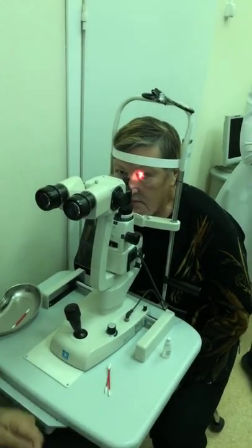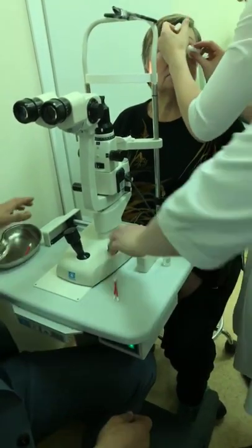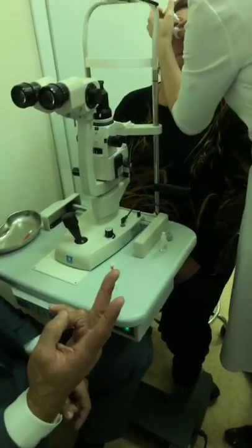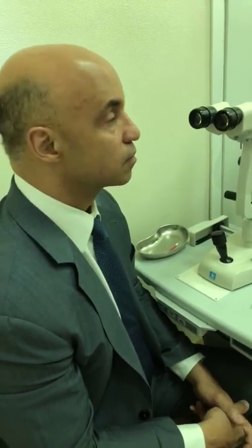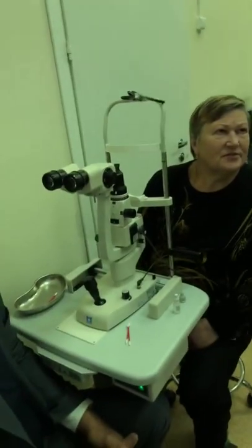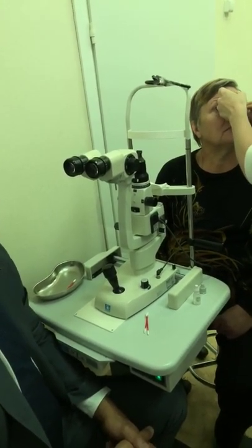Good. That's it. And then now I give her the anti-inflammatory, and then a drop of brimonidine, and she uses the anti-inflammatory twice a day for the next 3 days. Then she comes back in 2 weeks, and you do it again. She's going to need 4 treatments, because all her glands were making toothpaste. So she has severe dry eye disease.